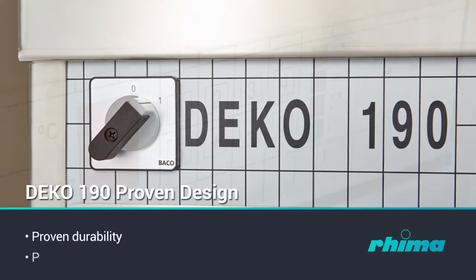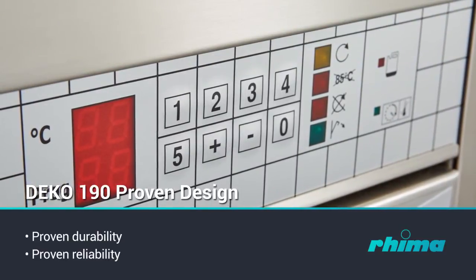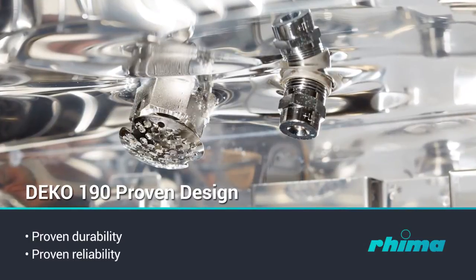Durability and reliability in continuous, heavy and busy institutional operating circumstances have been the key factors in the design of the DEKO 190.